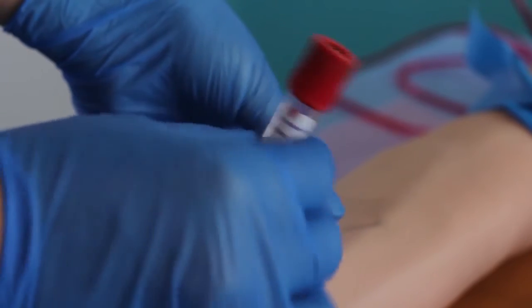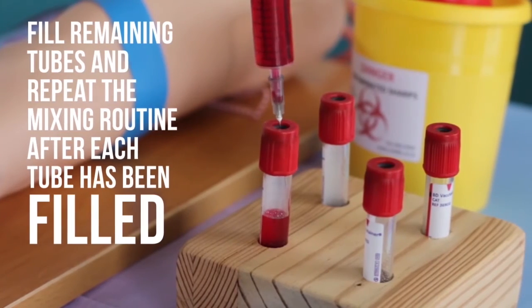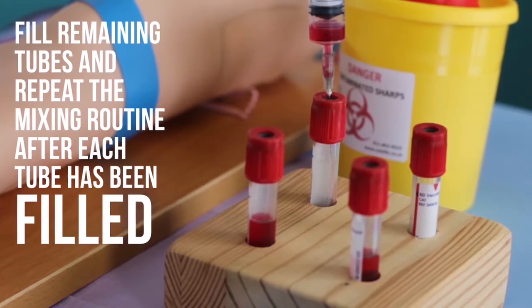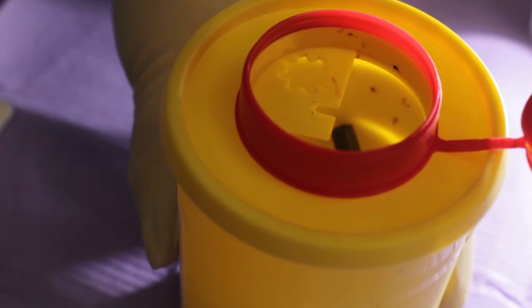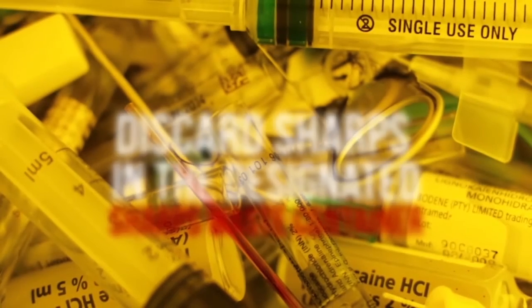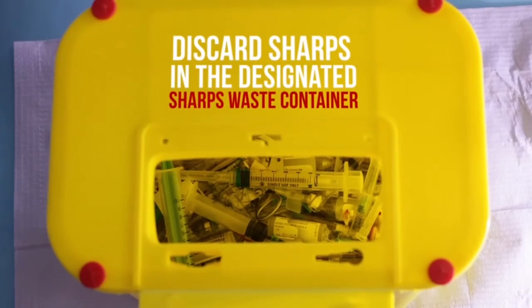Do not shake. Fill remaining tubes and repeat the mixing routine after each tube has been filled. Discard sharps, the used needles, broken glass, and syringe or blood sampling device into a puncture-resistant sharps container.